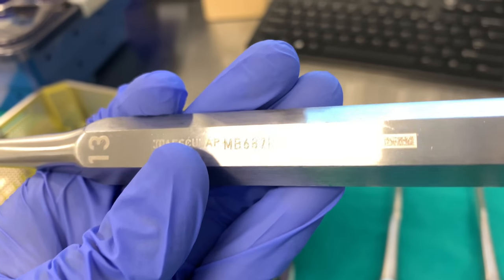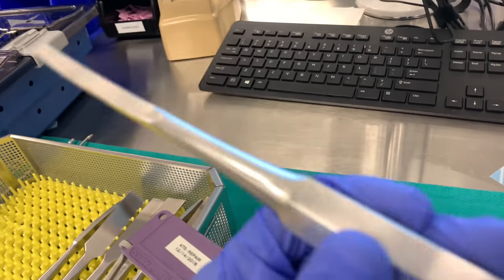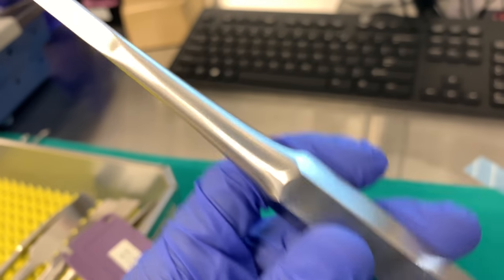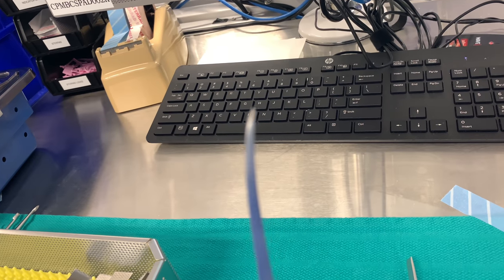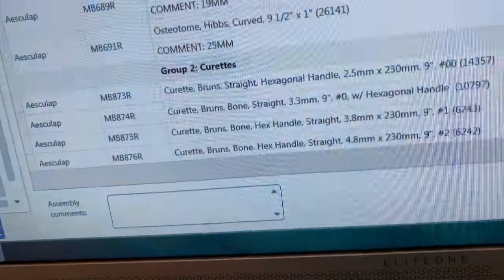This one's curved. 687R — 687R right there. And this one is 1/4 — this one doesn't have a code but this is 1/4 and it's curved.